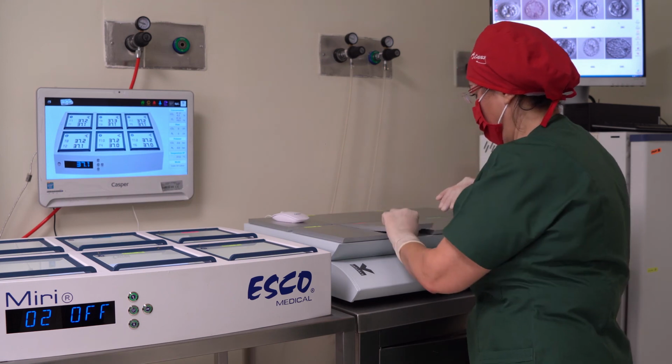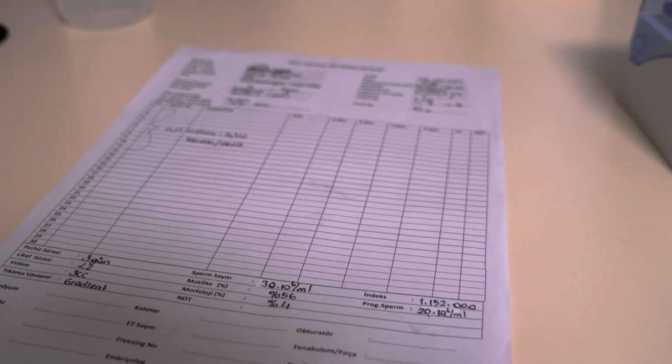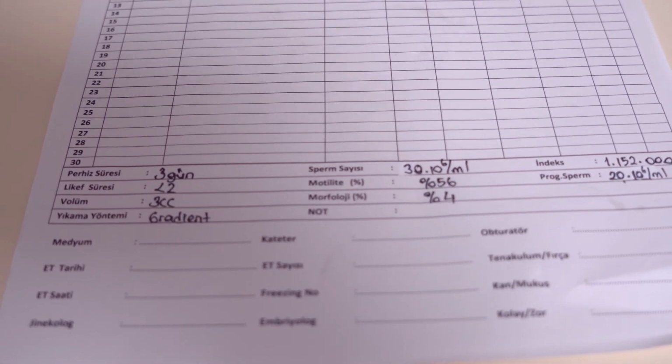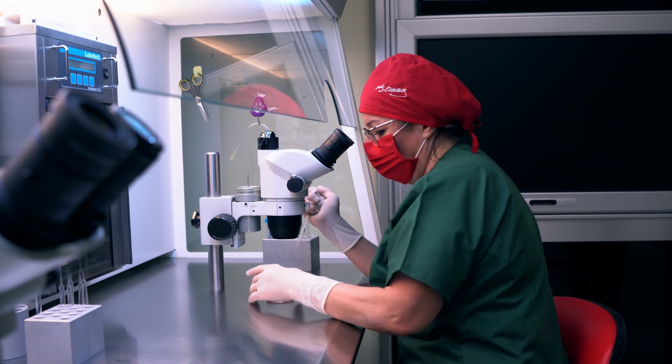Insemination time, the initials of the embryologist, and the progressive motile sperm concentration are recorded in patient files. Fertilization is checked 18 hours after insemination.